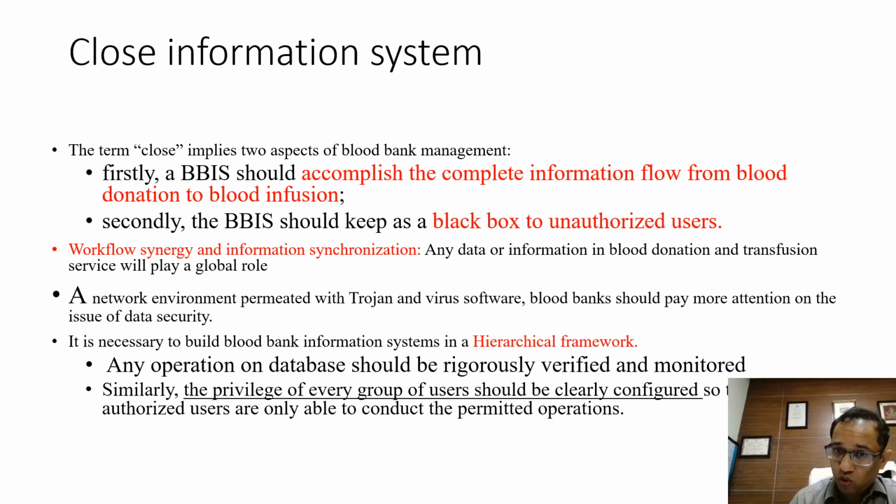Therefore, to combat that, we should have a hierarchical framework. That is, the privilege of every group of users should be clearly configured so that only the authorized users are able to conduct permitted operations.